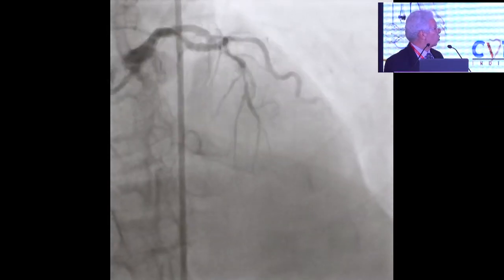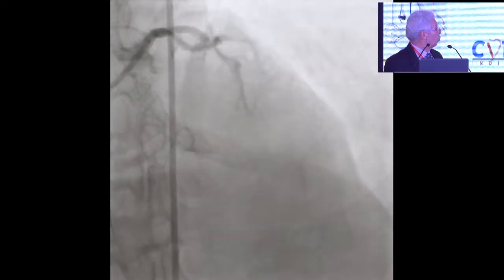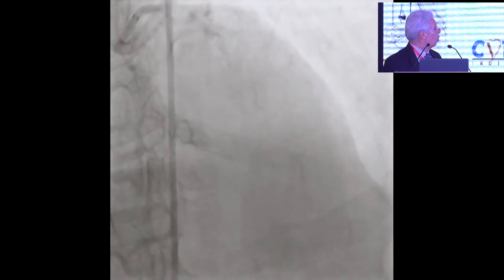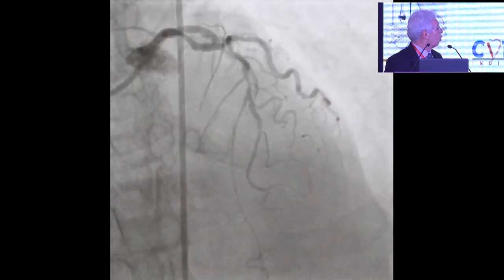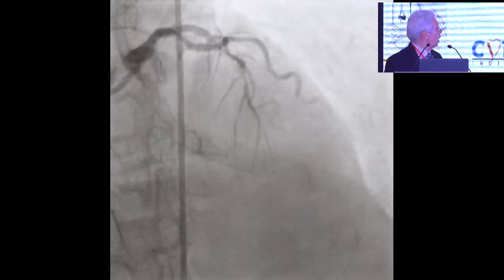decided that I'm not going to rota if this is a crossable lesion with a balloon, because I was worried that my rota would slide past the lesion and something would happen and I would need to go beyond the bifurcation. I was planning to stop here, but planning to use IVUS to see if this was a good landing zone. And geographically, I thought the landing zone just before the LAD bifurcates into the tiny thread-like LAD and the larger diagonal would be a good landing zone.